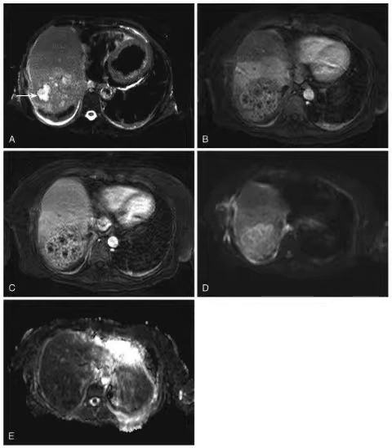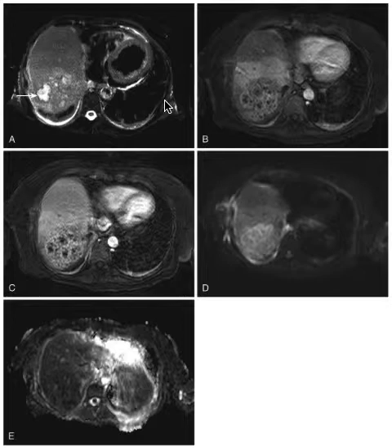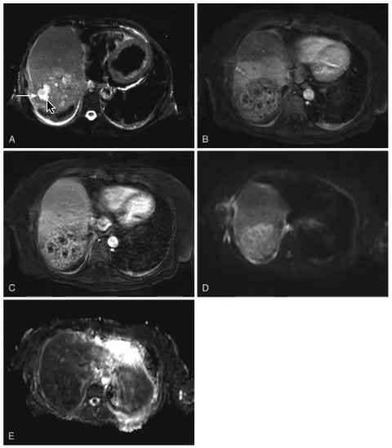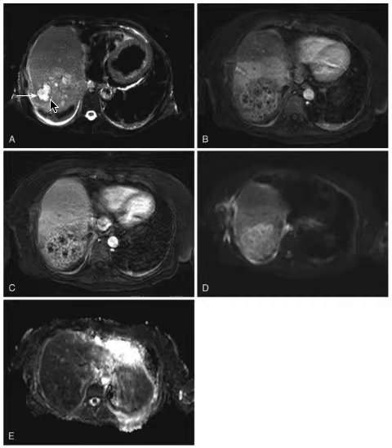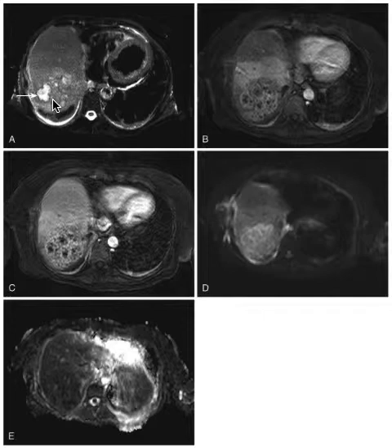On the first image, Image A, we have what we would call a moderate weighted T2 sequence, meaning the TE is going to be around 80. The heavy T2 weighted image can go up to 180 milliseconds. In this moderate T2 sequence, we see some hyper intensity. We also see different clusters of hyper intensities that seem to be joining together — they were probably separate lesions now growing and coalescing into a bigger lesion.